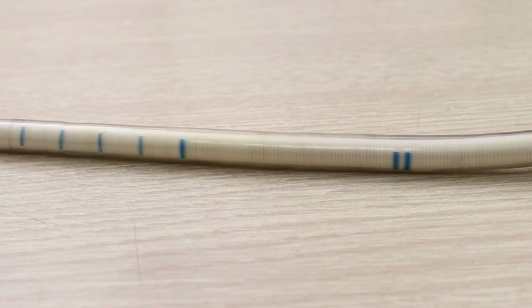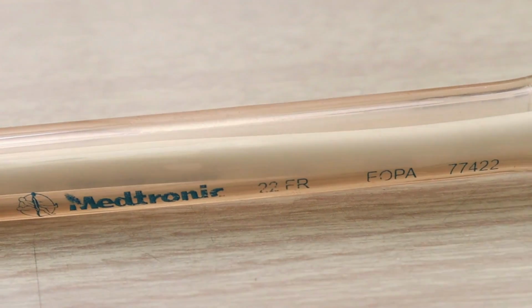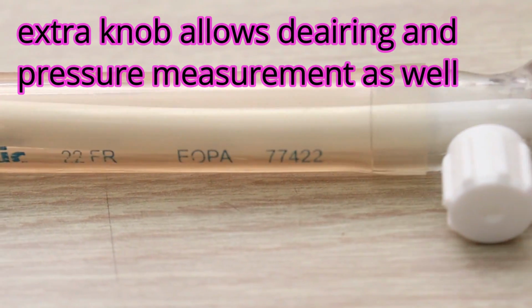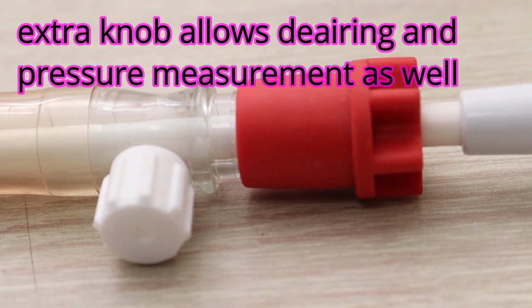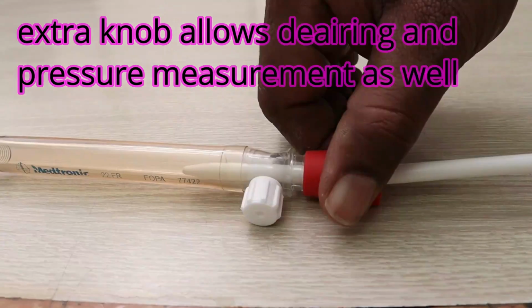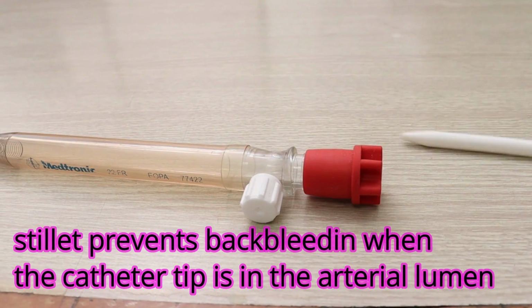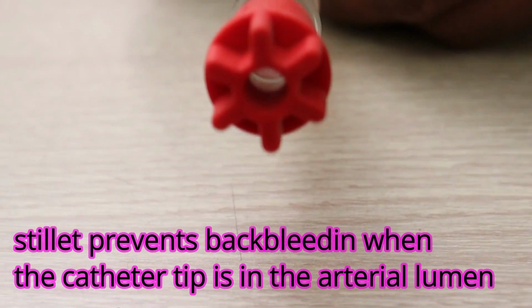As usual, there are markings on the cannula in terms of French, which will tell you the external diameter. There's a knob. This comes with a knob or without a knob. A knob helps you in deairing the cannula if there is air, and if you use it in the peripheral circuit, you can measure the line pressure, which says whether you're in the true lumen or false lumen, especially in dissection.